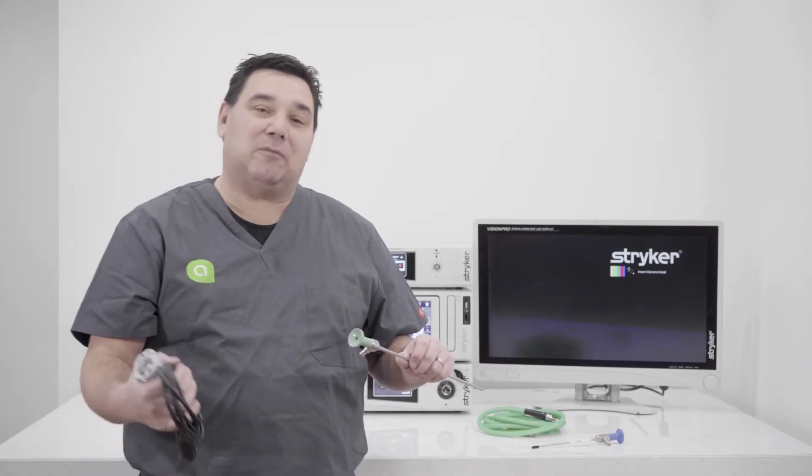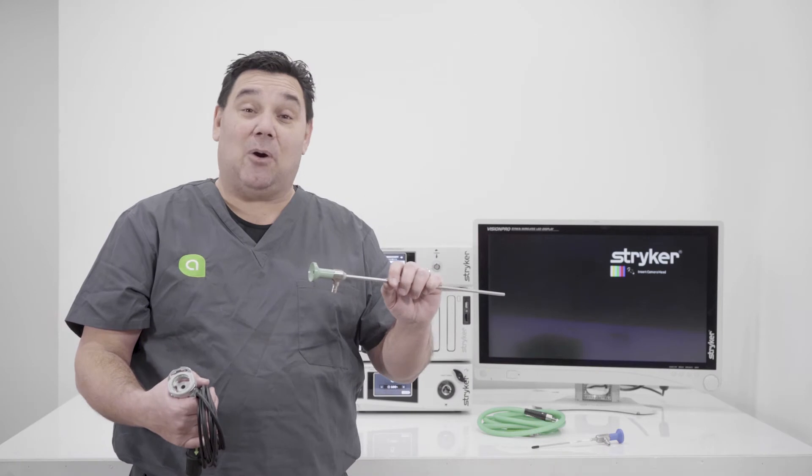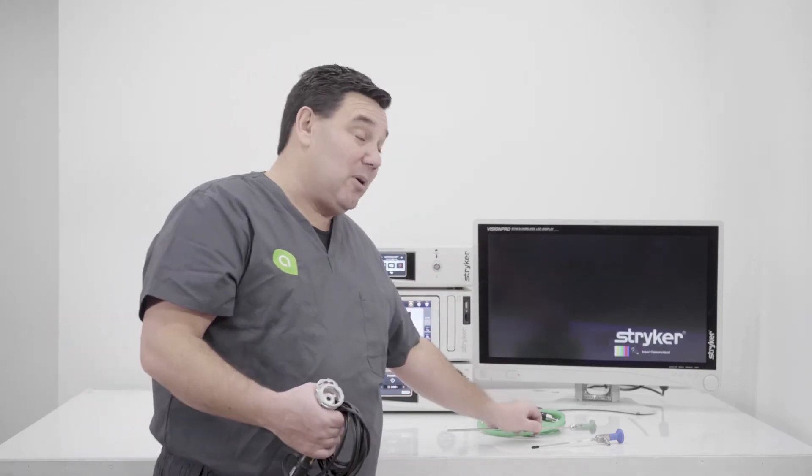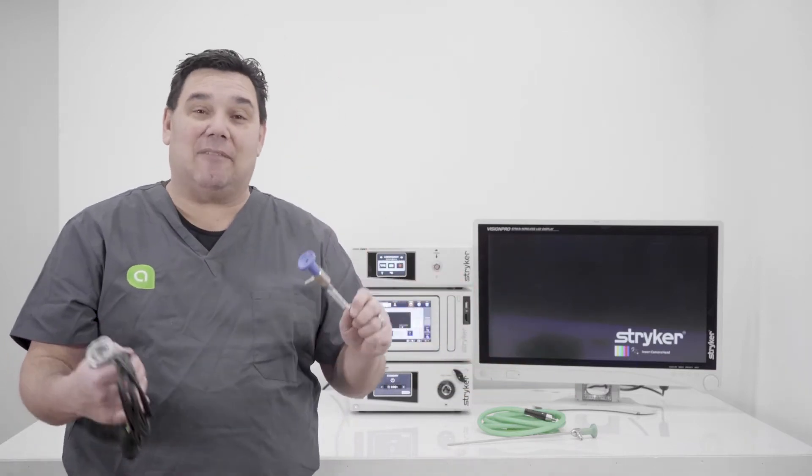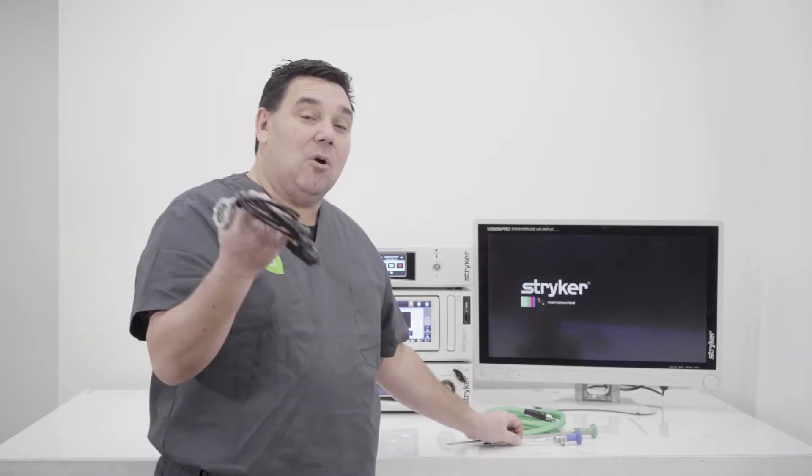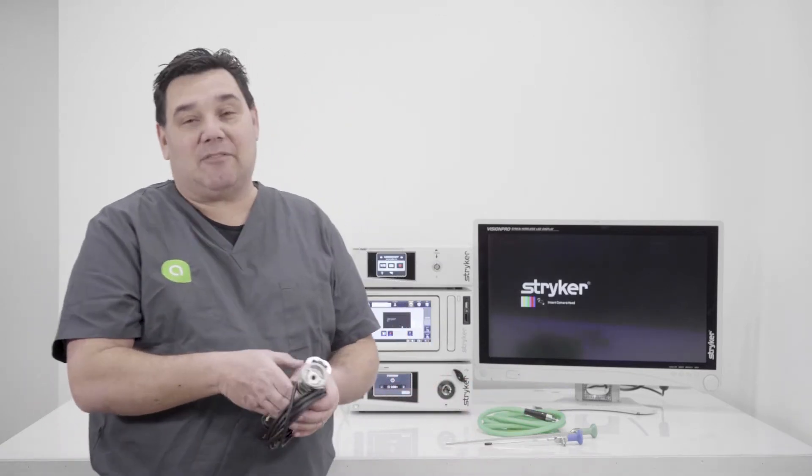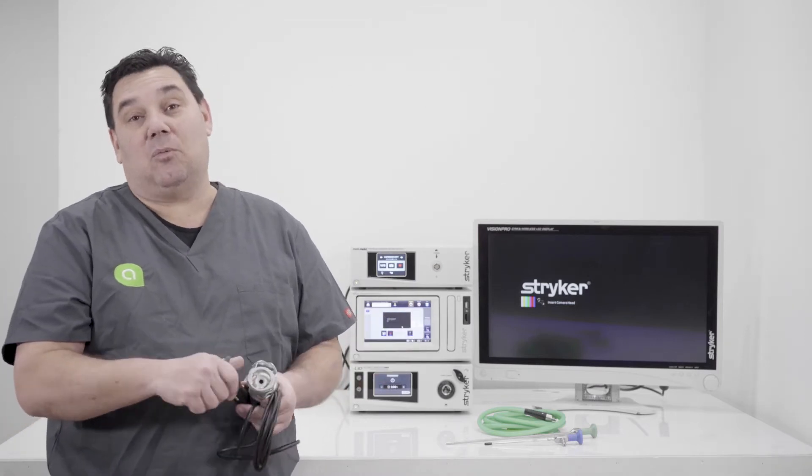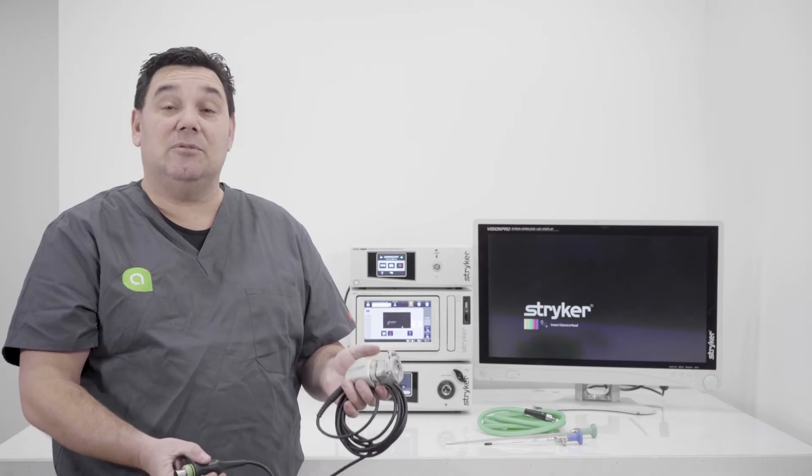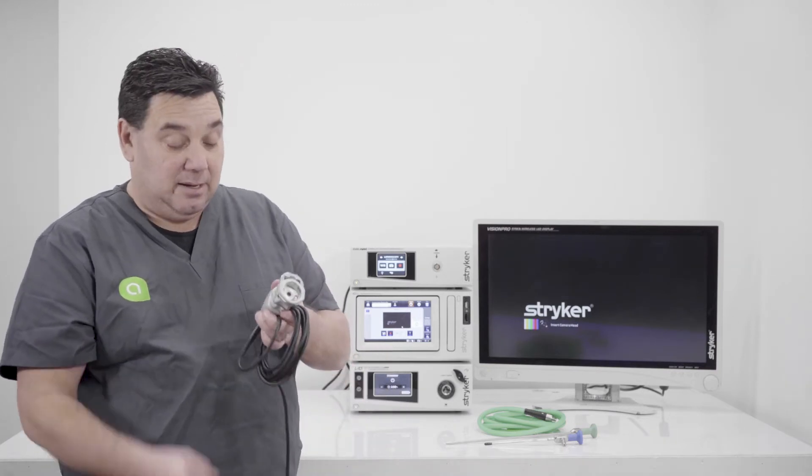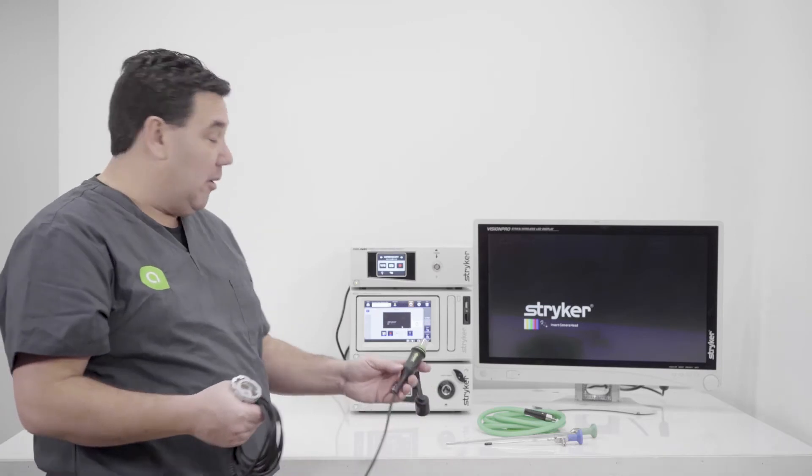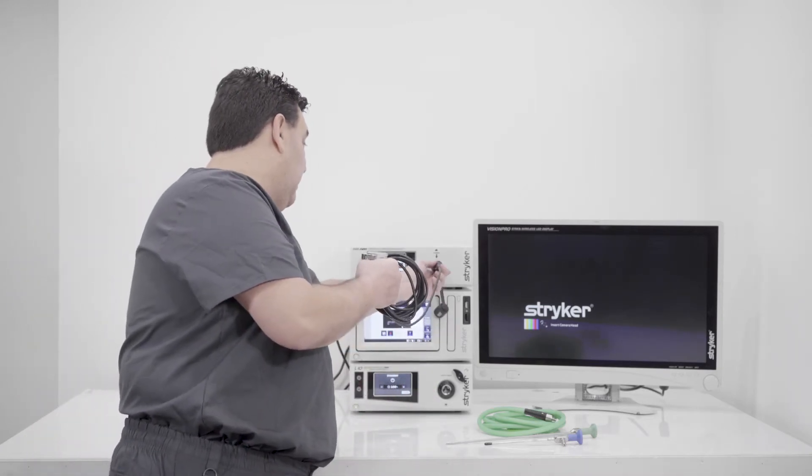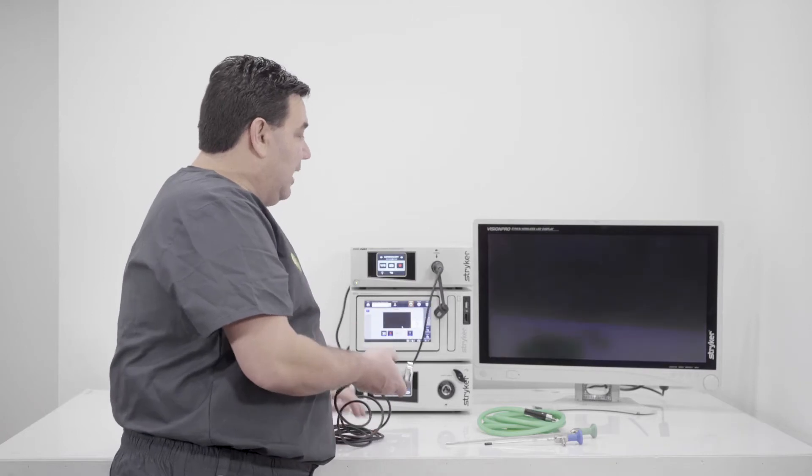So again, depending on what type of procedure you're doing, whether it be a laparoscope with a laparoscopy or an arthroscope with an arthroscopy, you need to make sure you have the right scope to be able to do the right procedure. But that's all going to start with the camera head. So you have to make sure you have a camera head with the corresponding box. So we're using a 1588 CCU. We're going to use a 1588 camera head and basically it's going to go green arrow to camera arrow up.